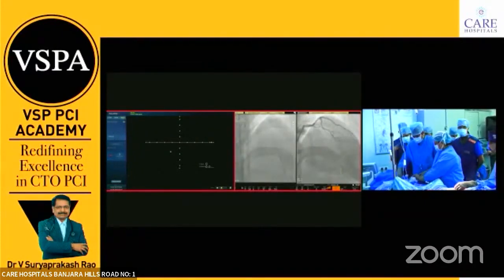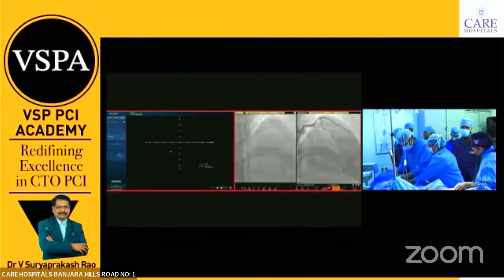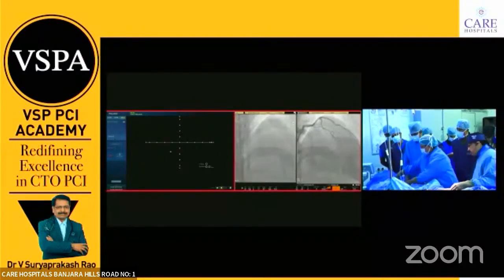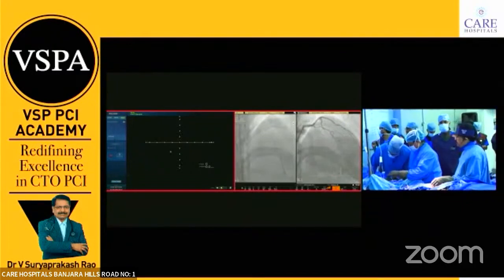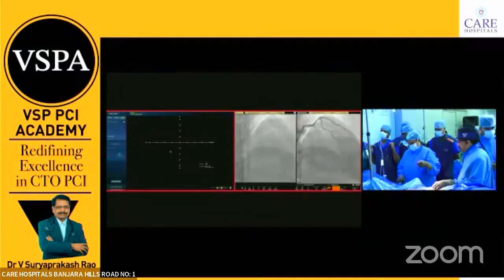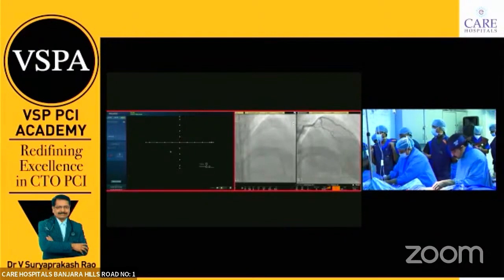The Boston, this is OptiCross, no? I find the resolution is very good. Only thing is the tip to transducer distance is a little more, 20. For a CTO operator, when you put it in the side branch, we are taking care of looking at the proximal ambiguous cap. The distance is too long. But if the side branch is long, yes, it is useful for seeing the proximal cap, and you can also puncture and come back. But the image quality is excellent.